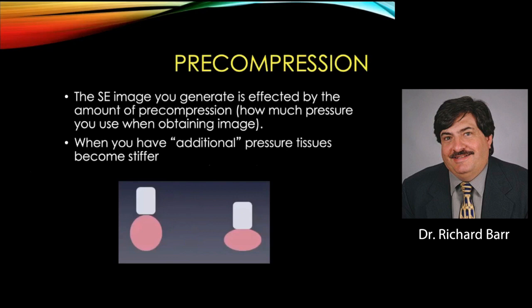All of elastography, particularly in superficial organs, is very dependent on what I call precompression. Some people call it preload. And basically, if you apply pressure with the transducer, then you are increasing the stiffness of the lesion and the breast altogether. And when you do this, you're going to get inaccurate results. For shear wave, the numbers are going to go up. So if you use a cutoff value, you may have false positives. In strain, it usually means that you're going to get just noise.